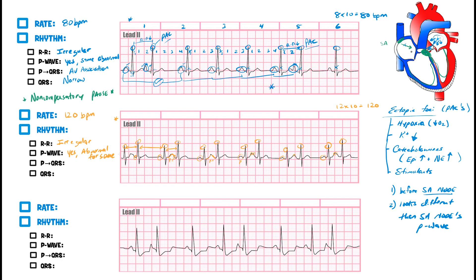I can't say with 100% certainty, but I'm about 90-100% sure this is a PT fusion. The QRS complex is coming much earlier than expected, meaning the ectopic P wave fired before it was supposed to — right at the end of repolarization, riding on the shoulders of the T wave. There is still a QRS complex for every P wave, so yes, there is AV association.